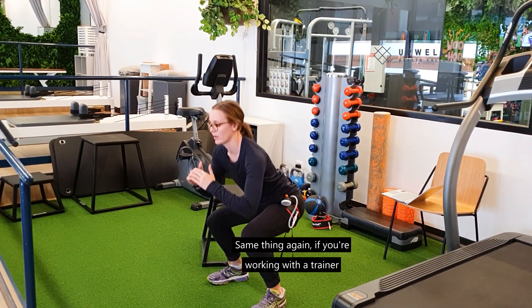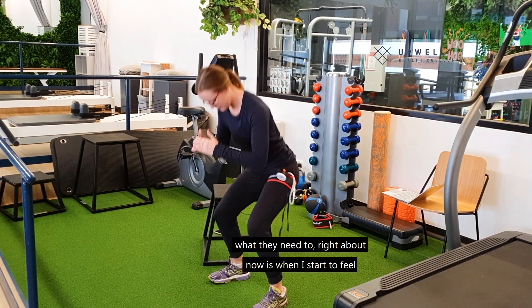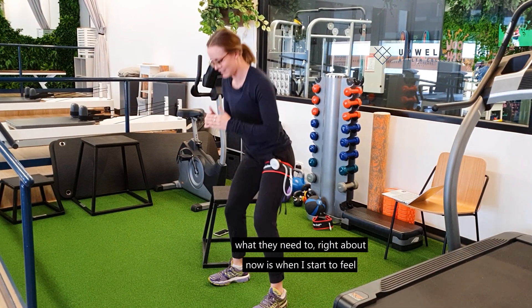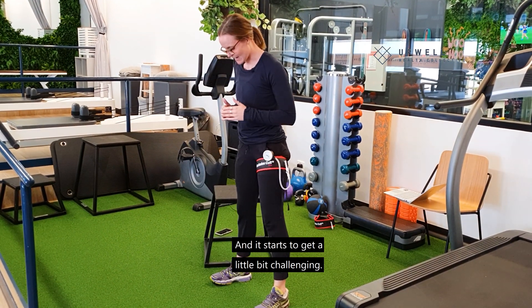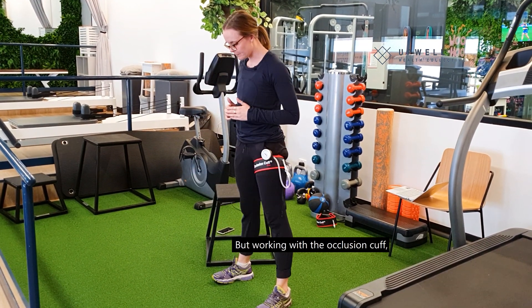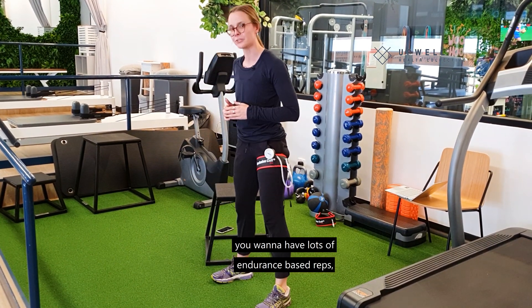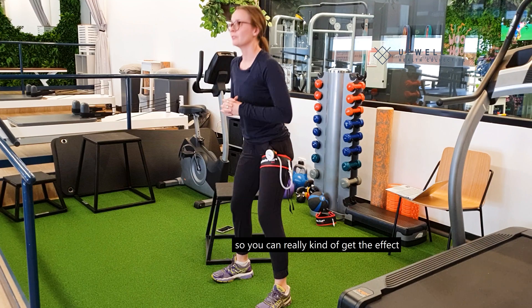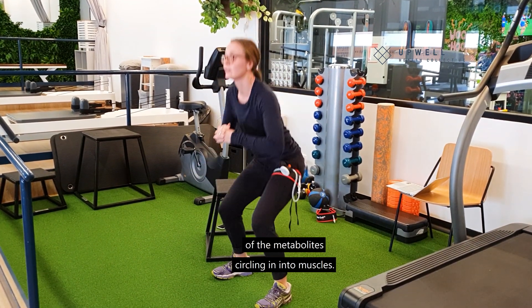Same thing — if you're working with a trainer or an exercise physiologist, they will work you through what they need to. Right about now is when I start feeling really fatigued in my quad and it starts to get a little bit challenging. Working with the occlusion cuff, you want to do lots of endurance-based reps so you can really get the effect of the metabolites circling into your muscles.